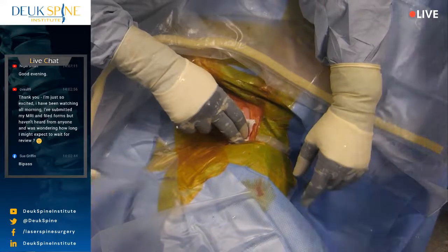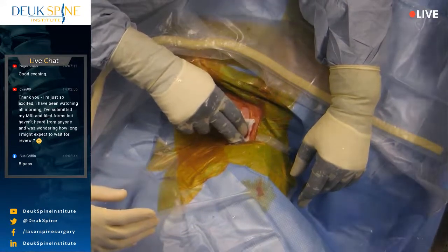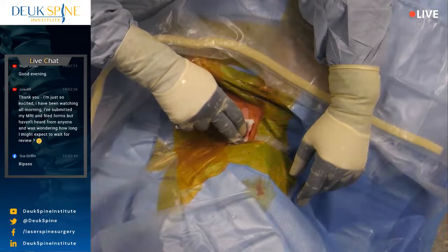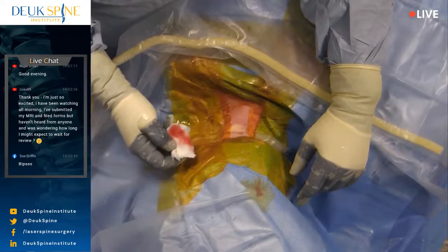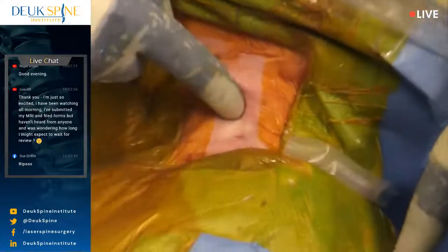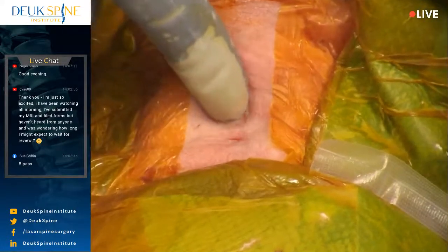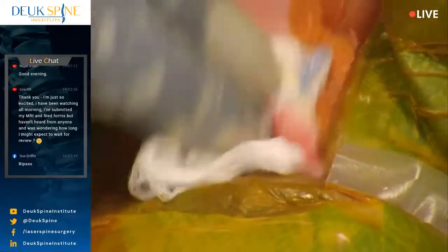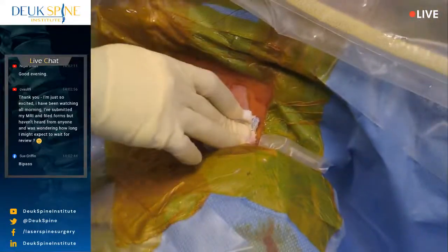Let's keep our blood pressure controlled. I don't want her spiking. So looks good. No bleeding. You guys see this incision right here? It's literally 4 millimeters. So incredible. Do another 2 minutes just to be 100% safe and sure.